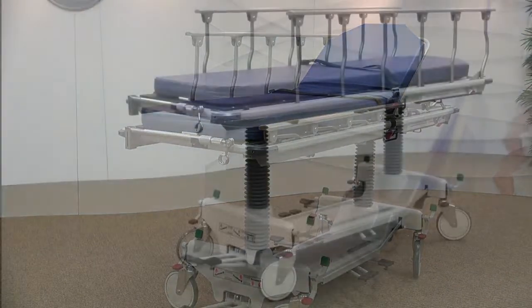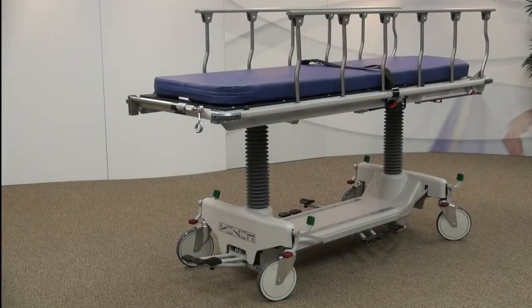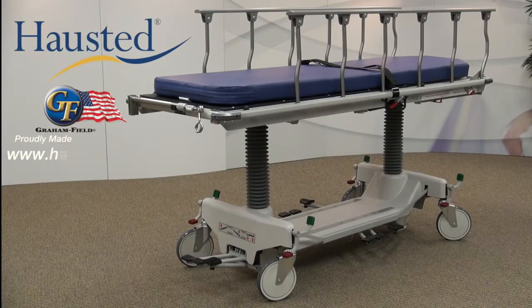To see how the Fluoro-Track Stretcher can help you improve case turnaround and streamline patient handling during fluoroscopy procedures, please contact your Hausted representative today for a demonstration.